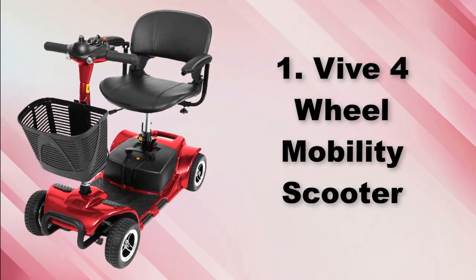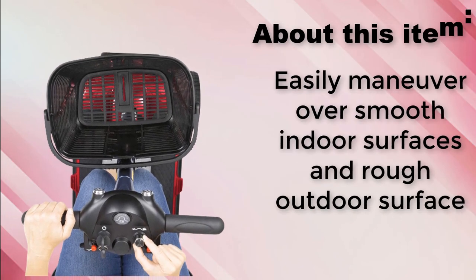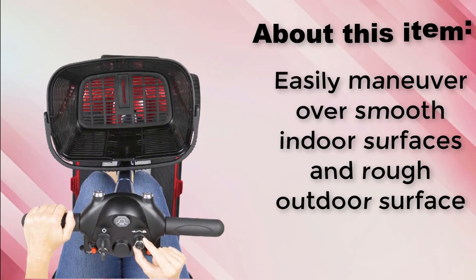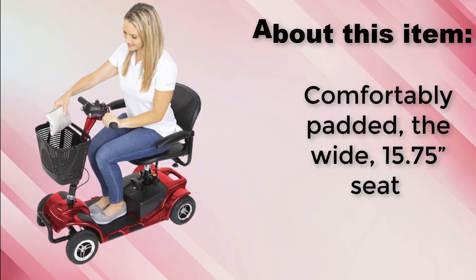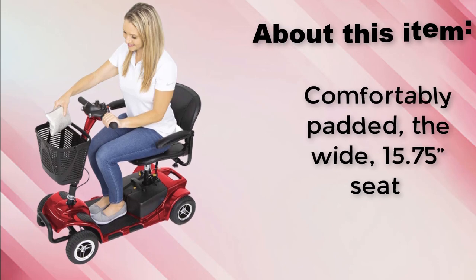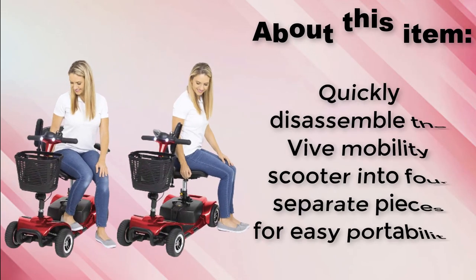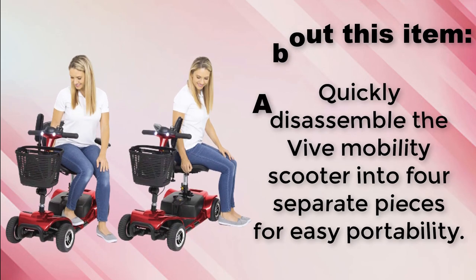Vive 4 Wheel Mobility Scooter. Easily maneuver over smooth indoor surfaces and rough outdoor surfaces. Comfortably padded, the wide 15.75-inch seat. Quickly disassemble the Vive Mobility Scooter into 4 separate pieces for easy portability.